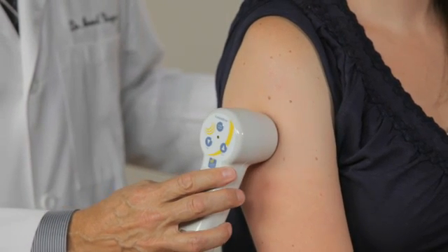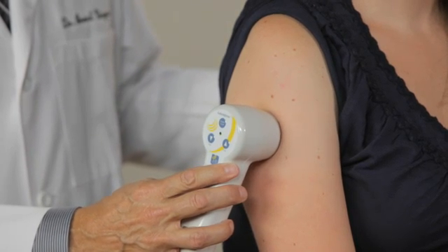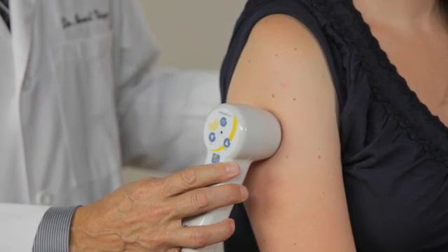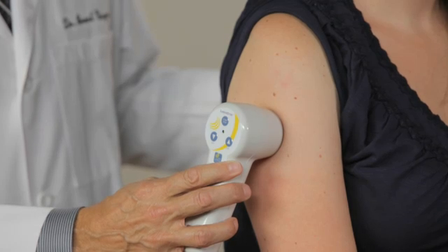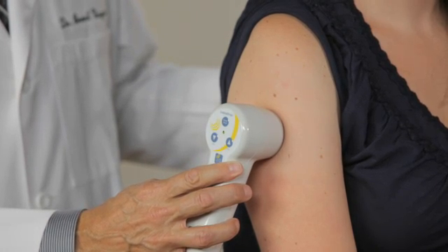We lift the head very gently, put it back on and at that particular time, it is now reading that impedance and we are doing the treatment as we hold the unit exactly where that point was at.